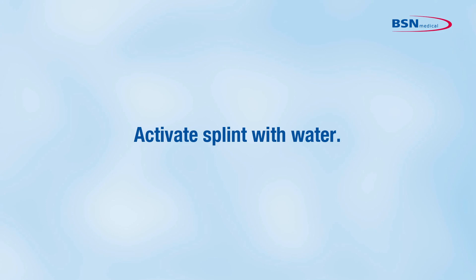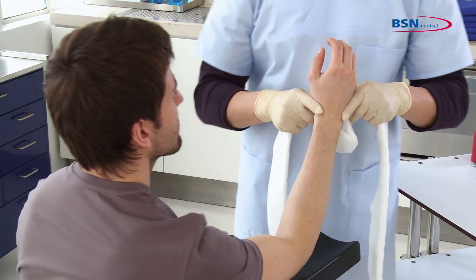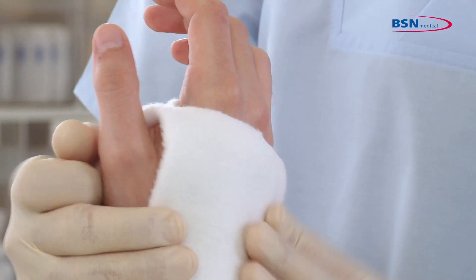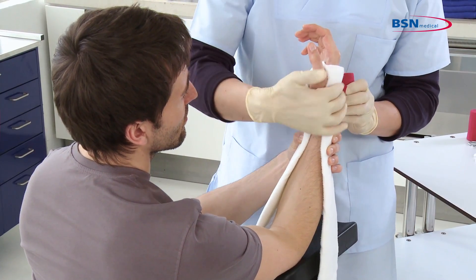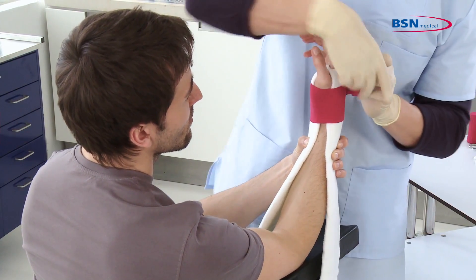Activate the splint with water. Afterwards, place the splint on the patient's arm by sliding the cut section over the fingers, with the attached section in the web space between the thumb and the forefinger. Align the splint with the medial and lateral sides of the arm.